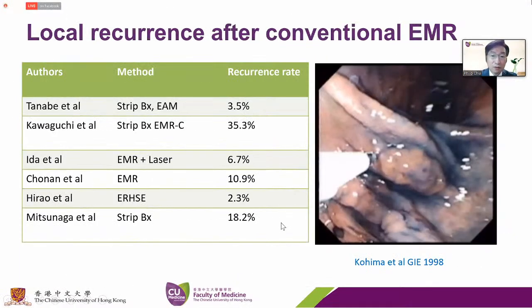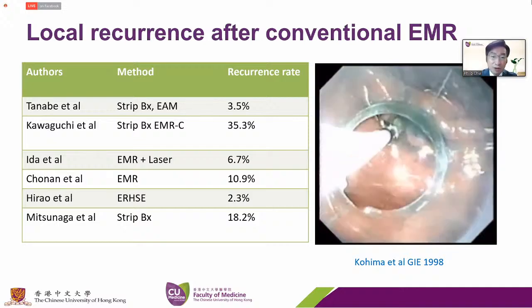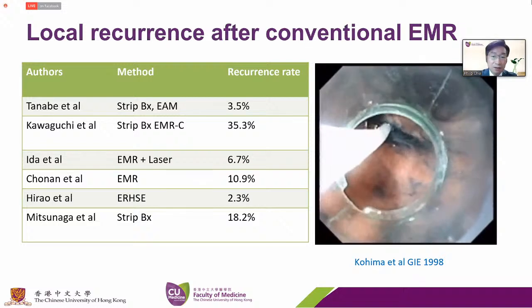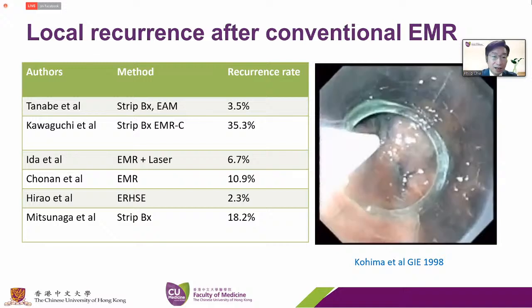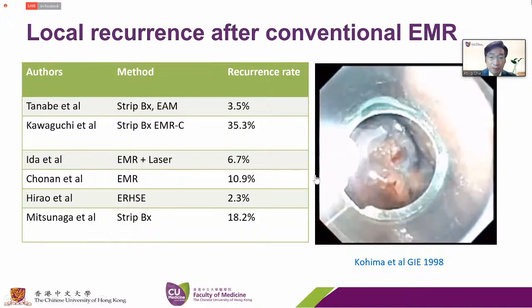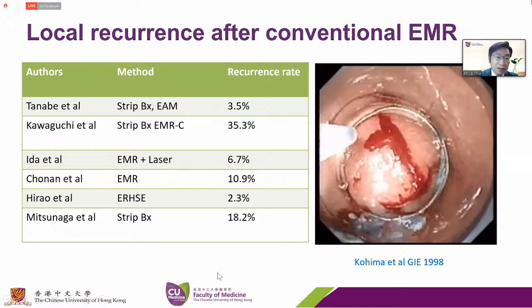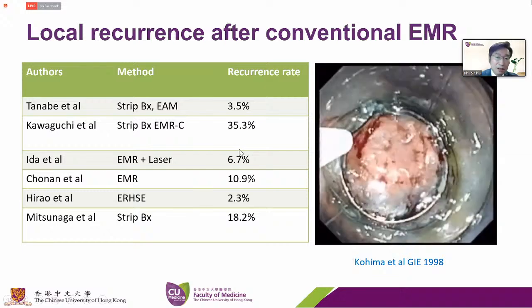In the past, we have already developed numerous methods to achieve endoscopic resection, ranging from polypectomy to EMR. EMR was specially developed to address the treatment of early GI cancer, pioneered by our Japanese colleagues. When you look into the technique, it is a modification of the polypectomy with the application of a snare after injection, and also a cap EMR. But there is a major variation in the local recurrence rate.